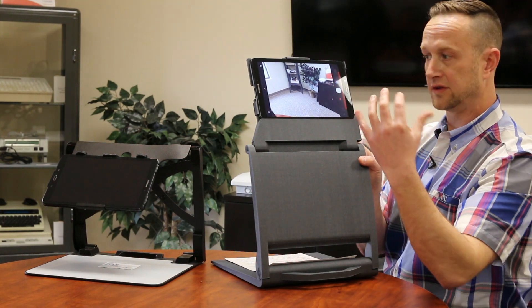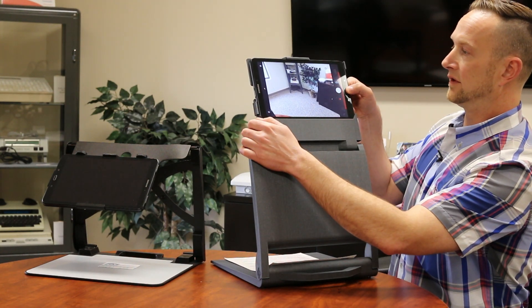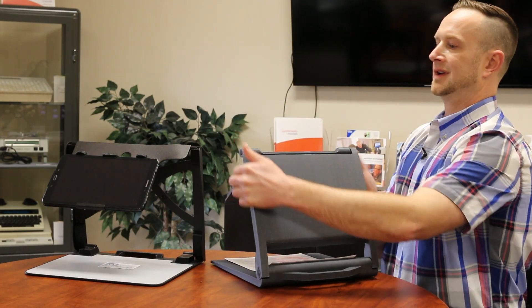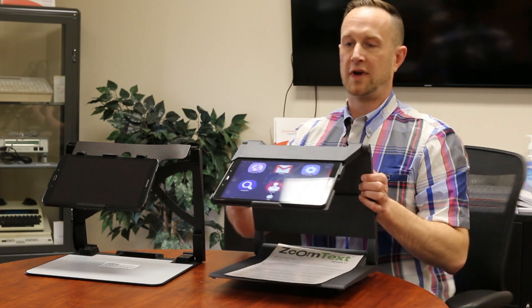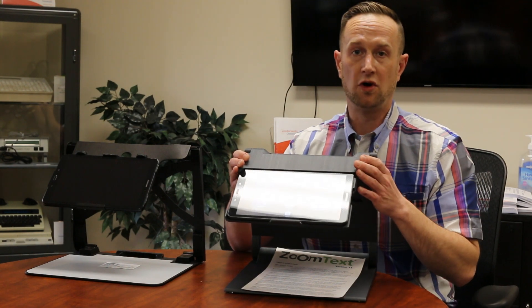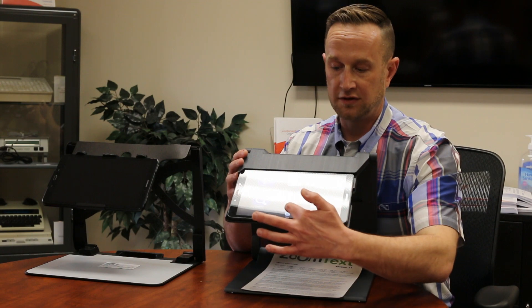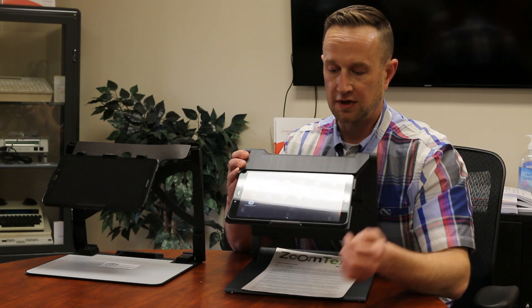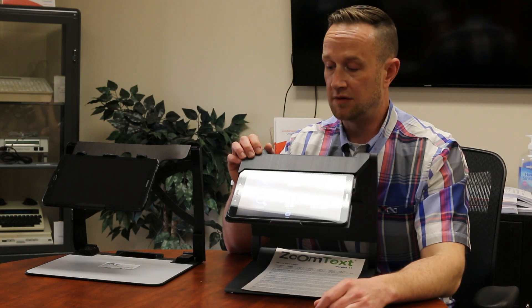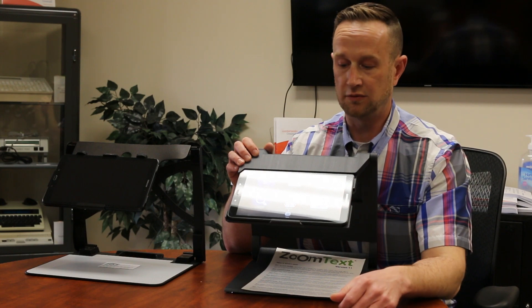You can turn this backwards into selfie mode as well. This is really a device that has all of the different features of all the typical video magnifiers in one, in addition to being a very small, portable, light package. You also have the App Store, and you can check out all of your apps, your email, or do anything online — basically any type of application with a tablet that you normally would.